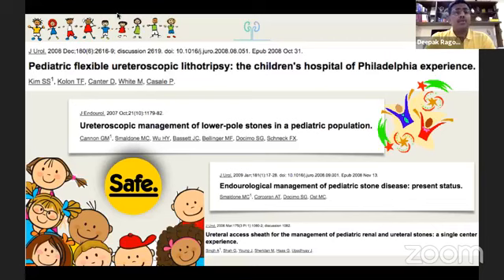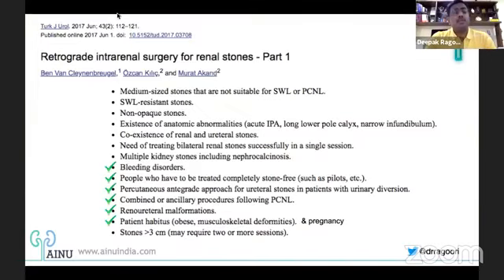And coming to pediatric ureteroscopy, of course, yes, it is indicated in pediatrics. It's a long-gone debate now. And I guess our next expert, Dr. Chandramohan sir, will be speaking in detail about pediatric flexible ureteroscopy. This is no longer a limitation. Yes, we can go ahead and do flexible ureteroscopy in children.